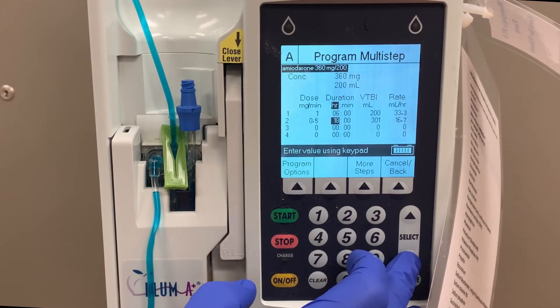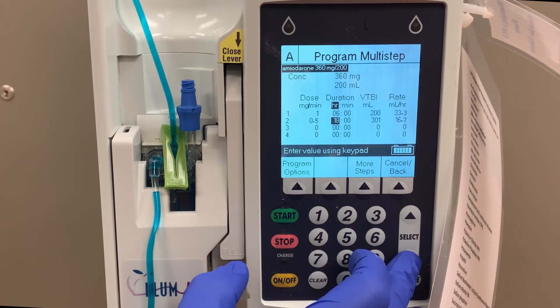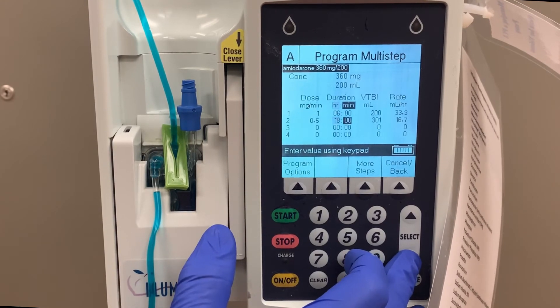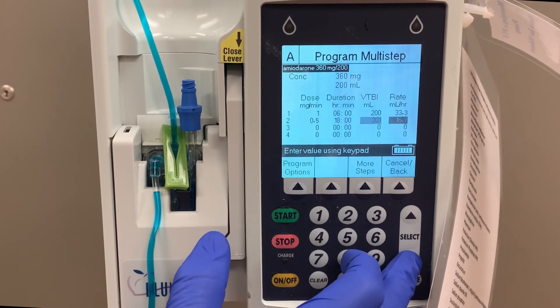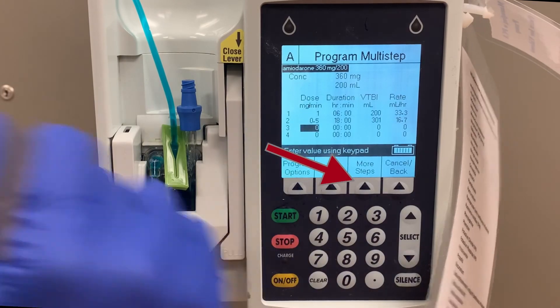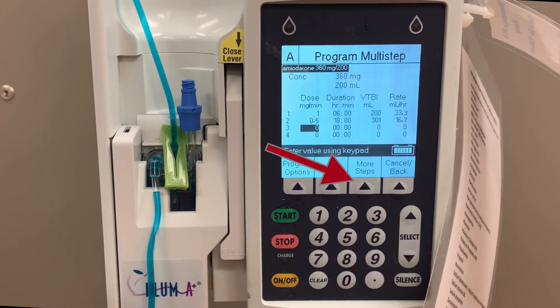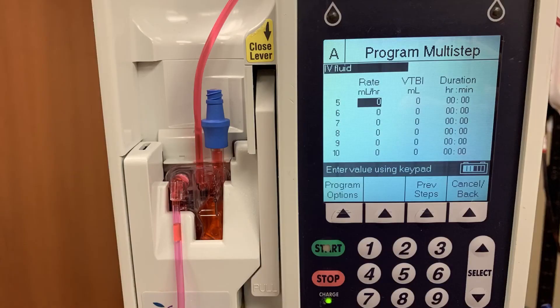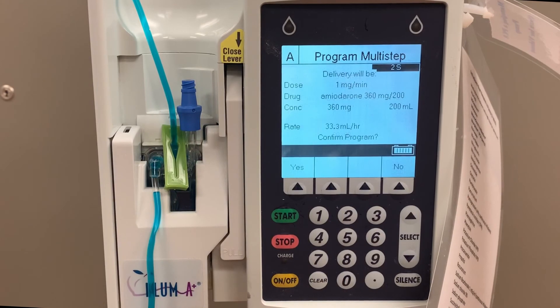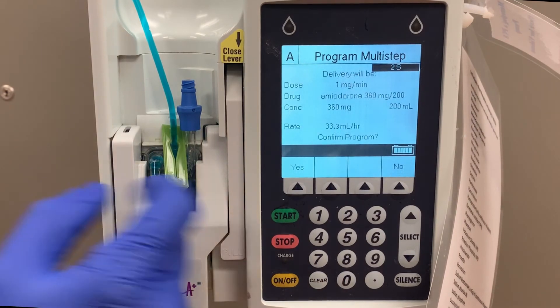Multi-step can allow the nurse to program much more intricate medications than just a two-step medication. By pressing the More Steps key, you can program up to 10 different rate changes on any medication. When your program is complete, press Start.